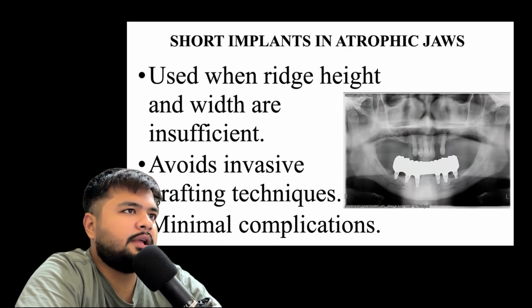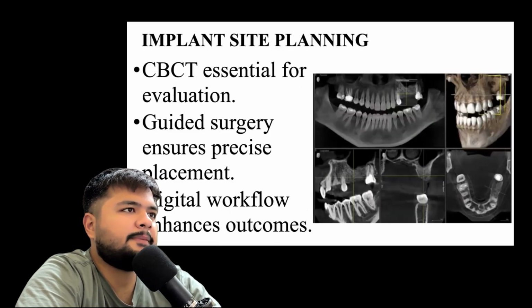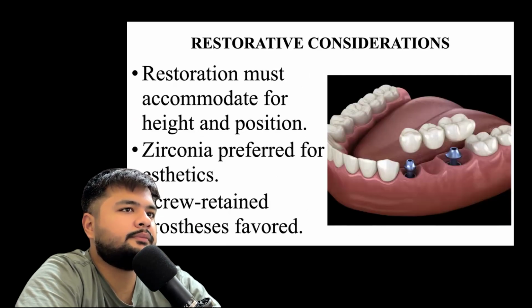Short implants in atrophic jaws, so used when ridge height and width are insufficient. Avoids invasive grafting techniques. Minimal complications. Implant site planning: CBCT essential for evaluation. Guided surgery ensures precise placement. Digital workflow enhances the outcome.